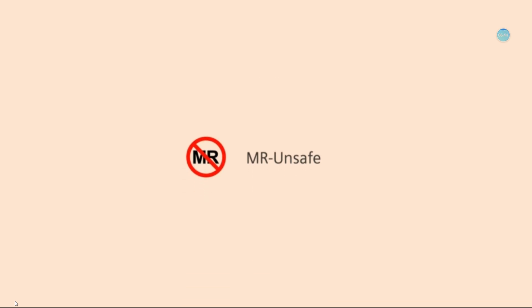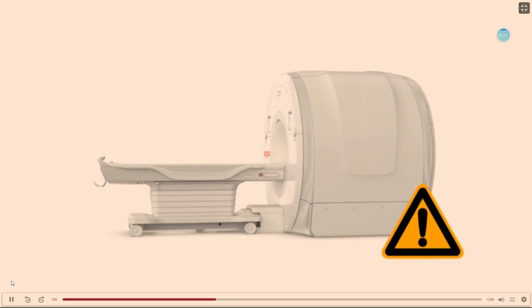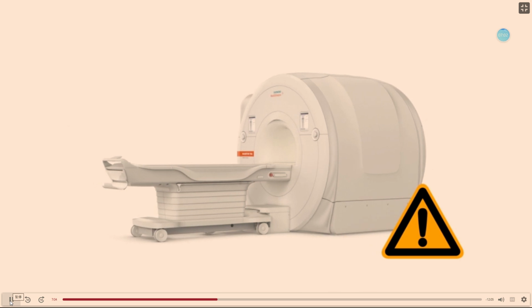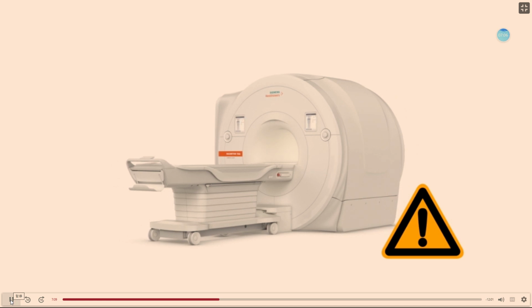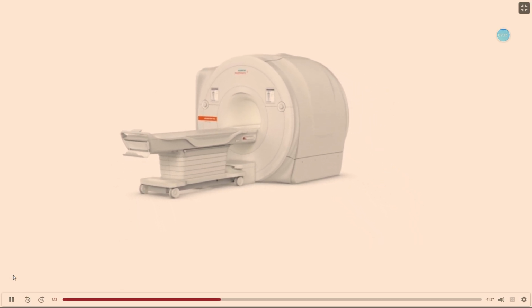MR unsafe objects are those which are known to pose hazards in all MR environments. MR unsafe items include magnetic items such as a pair of ferromagnetic scissors. Attention! Only use equipment in the MR examination room which is labeled as MR safe or MR conditional. All non-labeled scanner items have to initially be treated as MR unsafe.